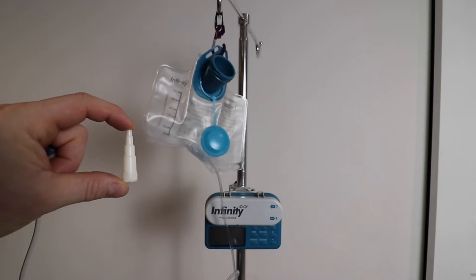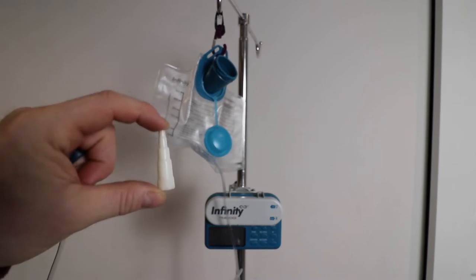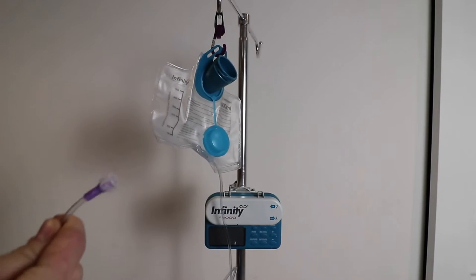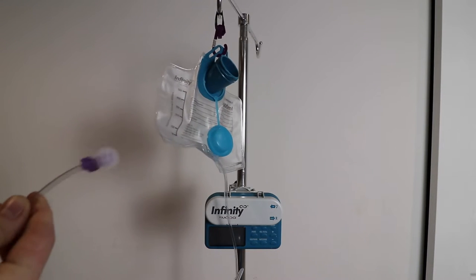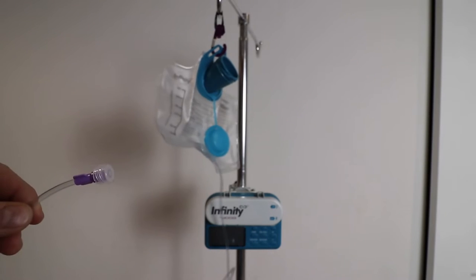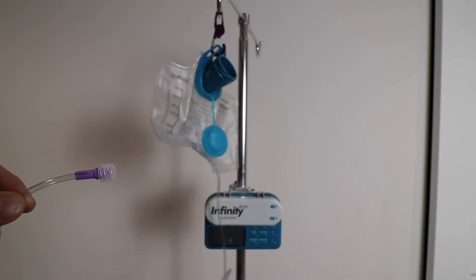We still have a few of the G-tube extensions left that take this adapter, so I will be screwing this adapter onto the end of the feeding tube. A lot of the new G-tube extensions — this just screws right into the extension.